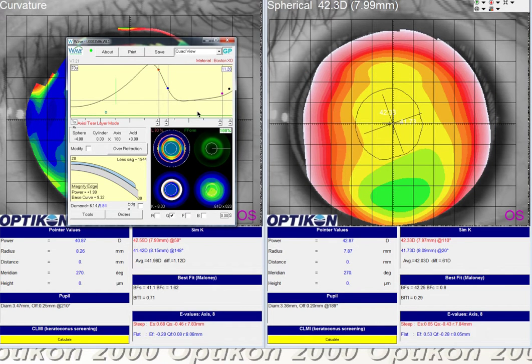It's in G-sim, and we have a little bit of clearance that shows in the horizontal meridian, in the periphery, and then some digging in of the edge superiorly, and then touching down inferiorly right at the back edge of the reverse curve.